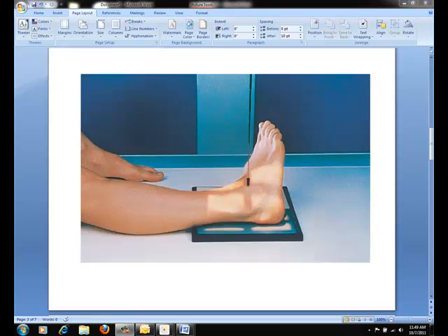As we begin to position the patient for the mortise view, grasp the distal femur area with one hand and the foot with the other. Assist the patient by internally rotating the entire leg and foot together 15 to 20 degrees until the intermalleolar plane is parallel with the IR. Be sure to dorsiflex the foot so the plantar surface of the foot is placed at a right angle to the leg. We will direct the central ray perpendicular, entering the ankle joint midway between the malleoli.